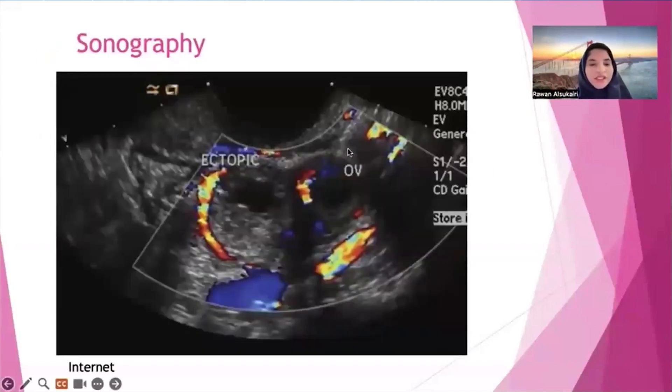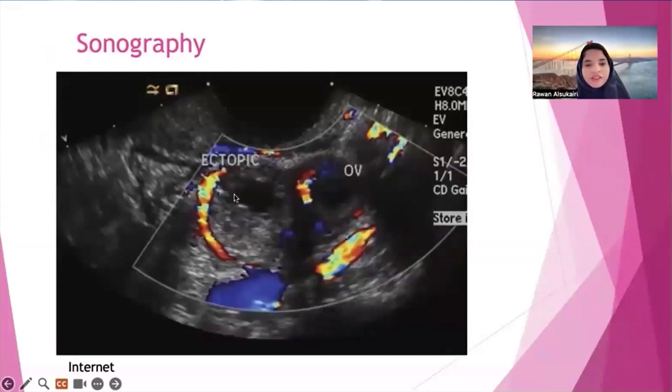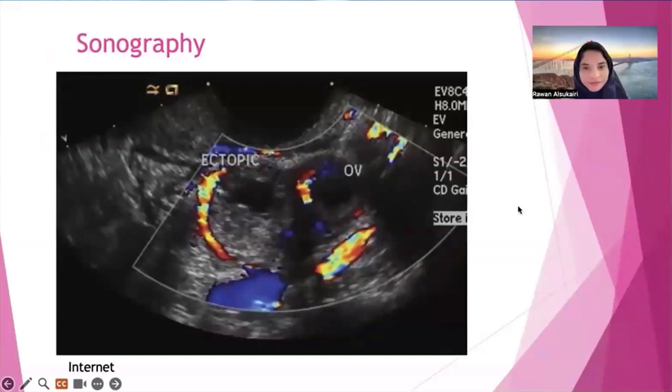Here in sonography, you can see the ectopic near the ovary — the ectopic adjacent to the ovary on one side of the adnexa.